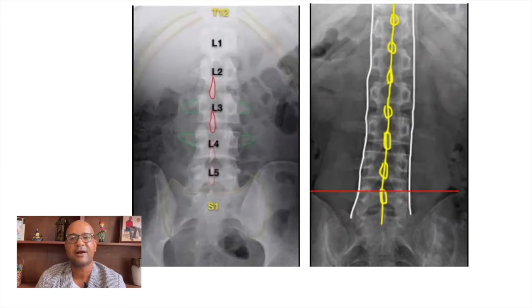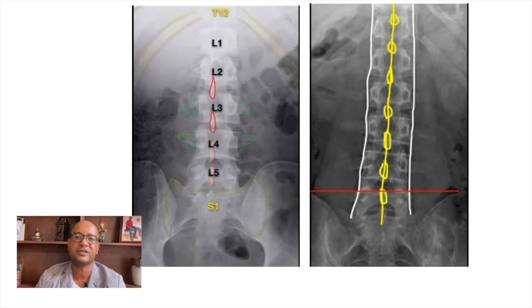For the AP view, the provider should be able to see the L1 to L5 and T12 vertebral bodies, the T11–T12 space, and the sacrum. For the lateral view, the vertebral bodies, transverse processes, facet joints, and pedicles should be clearly seen.